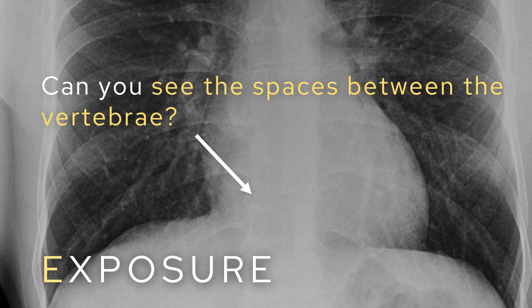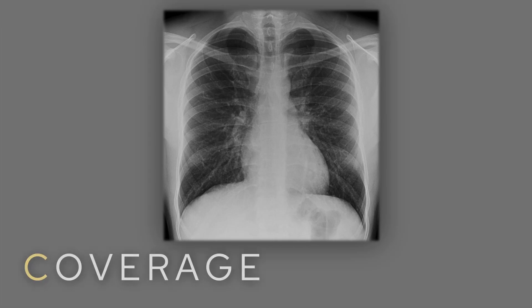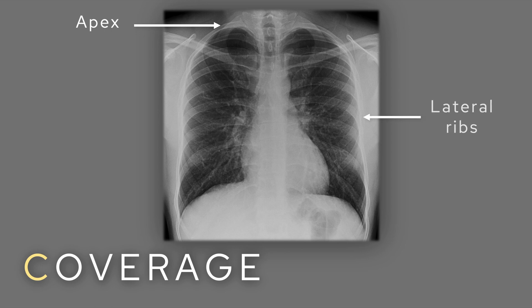Moving on to E for exposure. The most important thing is to be able to see the spaces between the vertebrae — if you can, the film is adequately exposed. This matters because if the vertebrae aren't clearly visible, you won't be able to comment on pathology behind the heart, which is a critical review area. Finally, C is for coverage. There are three things to check: first, the lung apex and first rib; second, all lateral ribs; and third, the costophrenic angles. If all three are included, there is adequate coverage of the film.